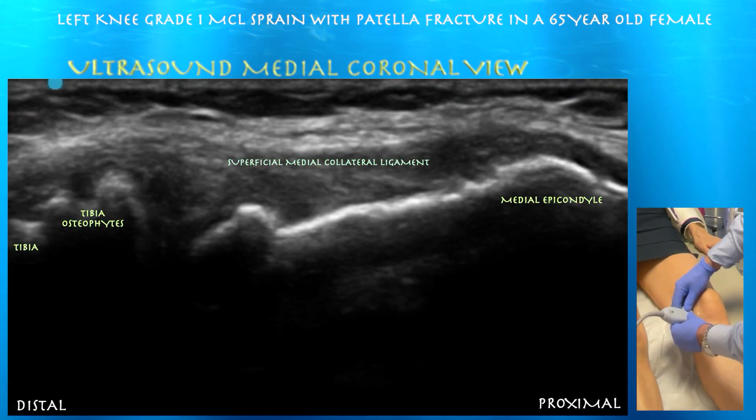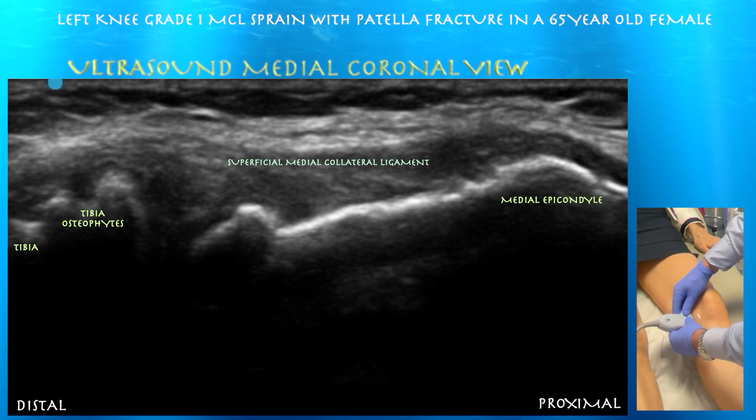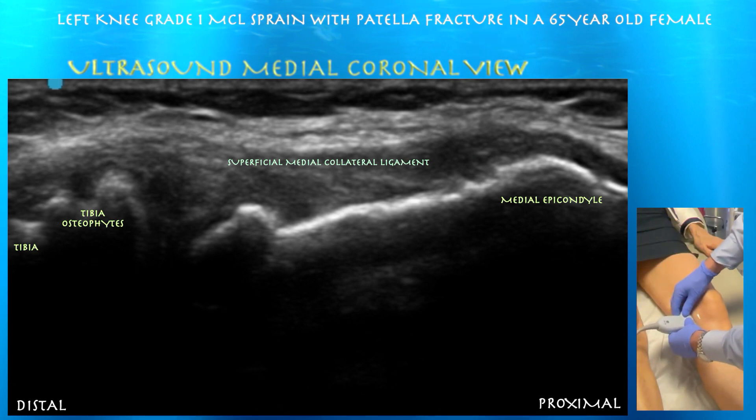Here we can see some hypoechoic signal at the proximal aspect of the MCL, consistent with a low-grade sprain. You can tell there is some thickening.